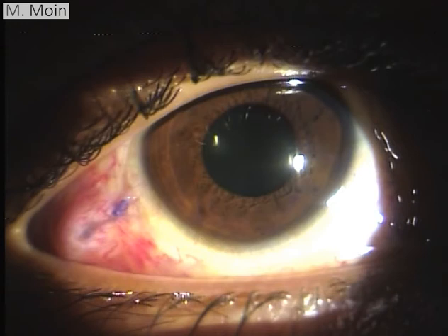It's important to identify where your sclerotomy marks are. Usually if it's the right eye, the inferotemporal mark will be inferior to the insertion of the lateral rectus, and the superior will be above the lateral rectus, while the nasal sclerotomy will be above the medial rectus muscle. So in hours, it'll be 7, 11, and 2 o'clock or 1 o'clock, depending on how you are doing surgery. If you have your sclerotomy site at 10 o'clock, probably you will get more leverage. You can move your endoilluminator or probes easily around, but if you're more superior, you will have difficulty maneuvering it superiorly. So the further down you have it, the better, but you don't go below the central meridian. So 10 o'clock is probably the ideal position.